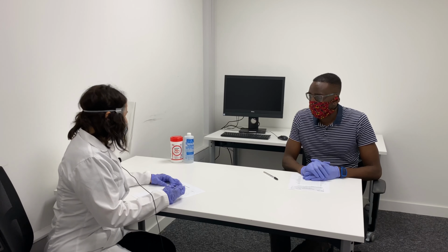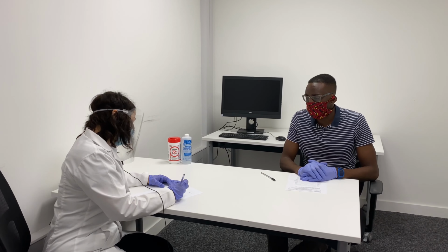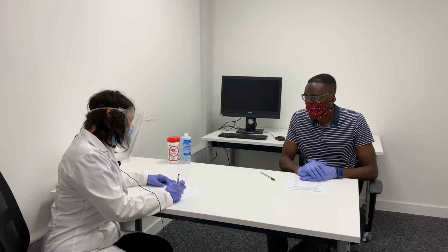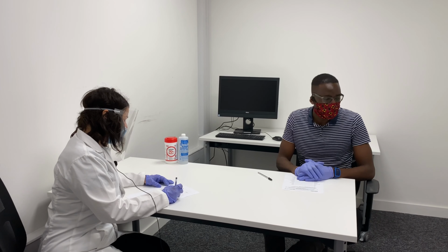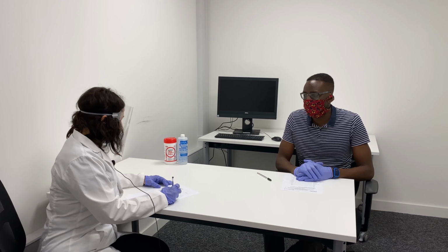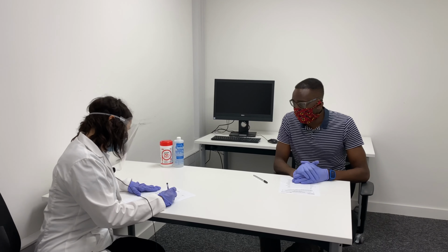Andrew already signed informed consent that he wants to take part in our study and that he is aware of all the regulations. Before we start with the EEG, I'd like to ask Andrew a few questions which apply to our study. So, Andrew, did you drink alcohol in the last 24 hours? No. Did you take any medication in the last 24 hours? No, none at all. Did you smoke in the last 2 hours? No. When did you smoke your last cigarette? Approximately 15 years ago. Okay.